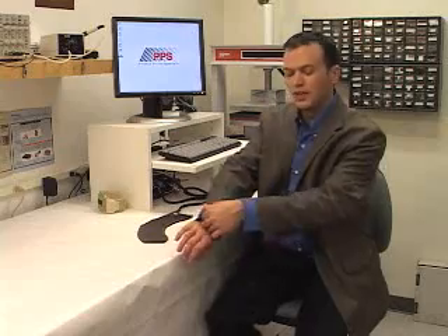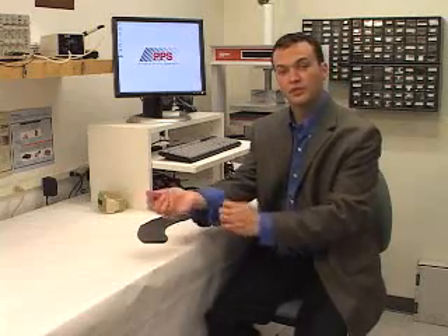You might choose to use a stretchable tactile array in the design or evaluation of joint stabilizers or athletic braces. For this example, let's investigate the fit of a typical tennis elbow brace.